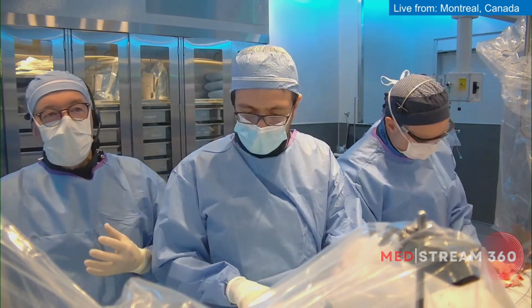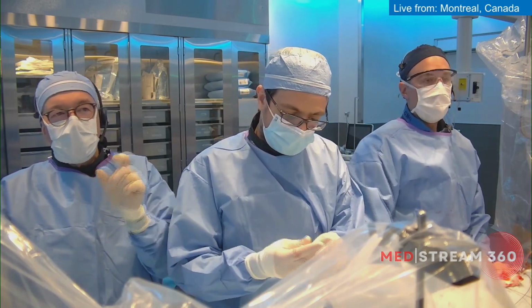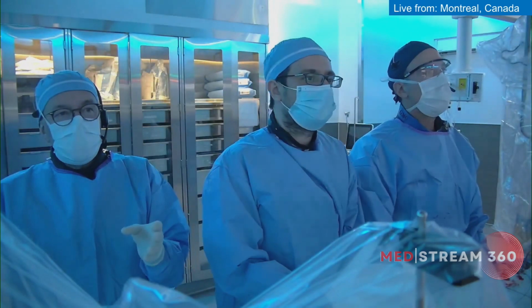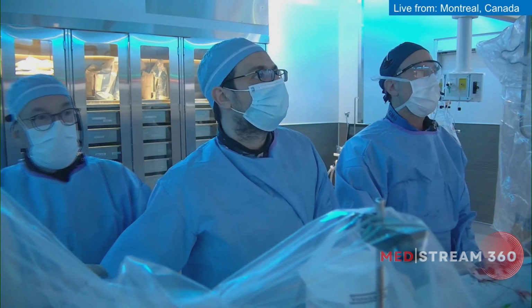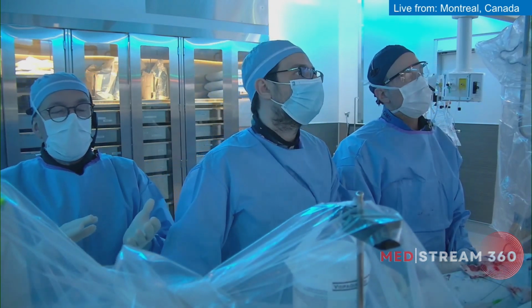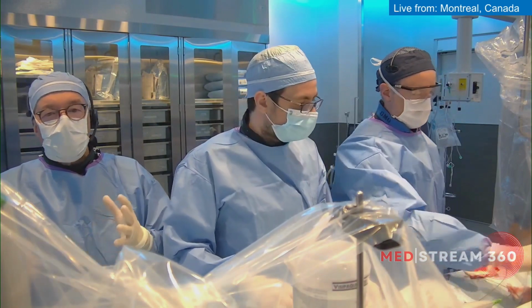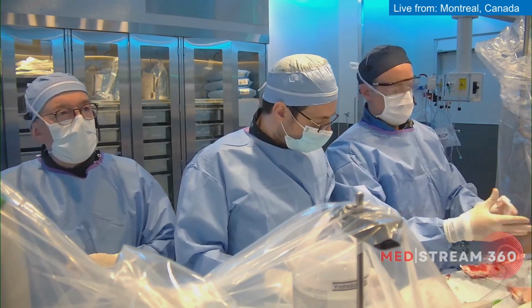So we probably don't need physiology for the left. We were planning more imaging to look at the landing zone of the stent in the proximal LAD with the left main. The goal today is to treat the LAD first, with its multi-site lesions and calcium, which we will show you in the IVUS in a few seconds. The next lesion we will do will be the right, and then use physiology with co-registration to demonstrate which lesions are significant and require a stent. That will be the co-registration with the Philips system.